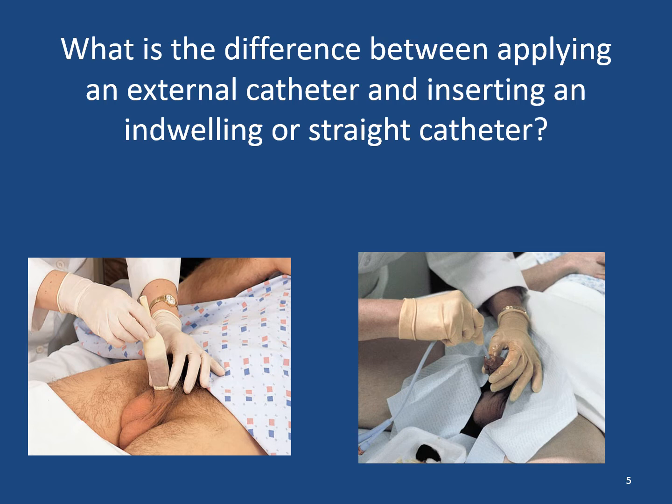So indwelling catheters are used for retention, to provide continuous bladder drainage, and to provide urine flow perioperatively, to closely monitor urine output of critically ill clients, and then we can actually assess their kidney function as well, tying in some fluid and electrolytes here, to protect skin from urine, especially if somebody has extreme skin breakdown.